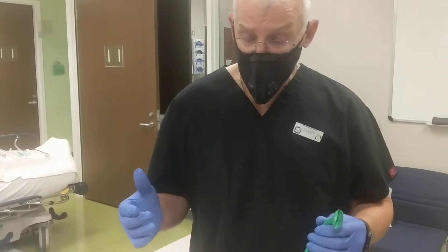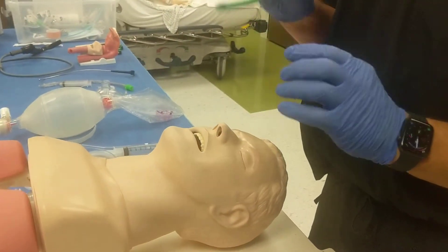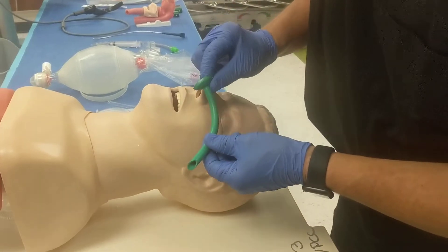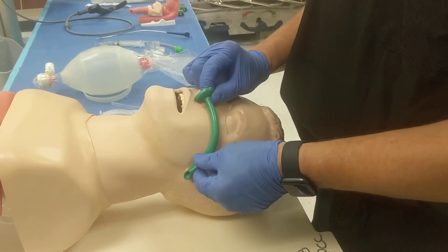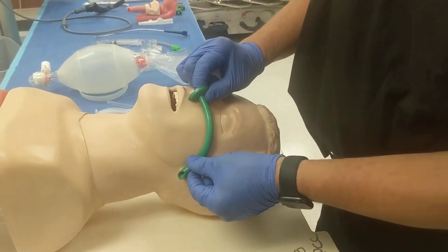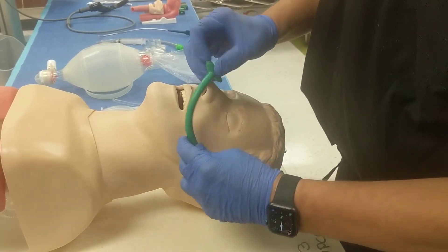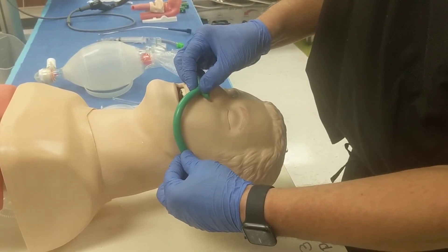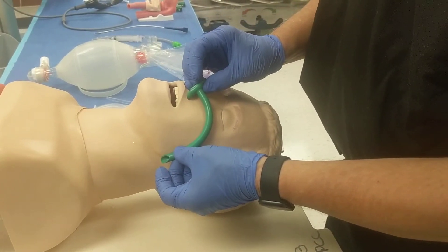We want to size first, since we want to get around the back of the tongue. It's very important that this be long enough. This is sized by putting the trumpet at the nares and then making sure the angulated end reaches the tragus of the ear. You can see this is the exact perfect size for this mannequin. A mistake would be to turn it the other way — put it in the way it will be oriented once it's in the patient.